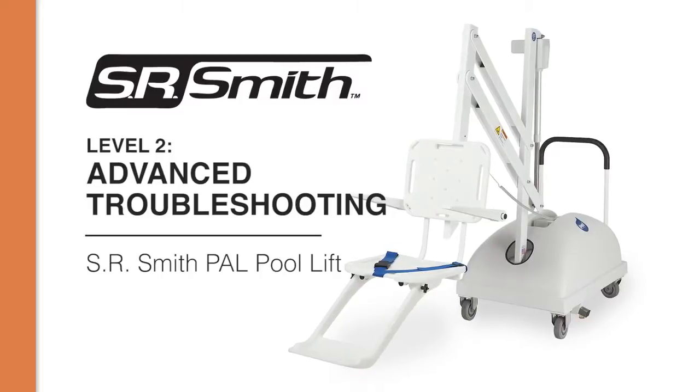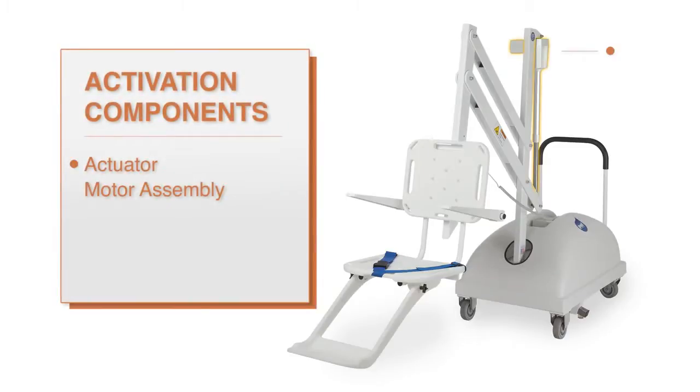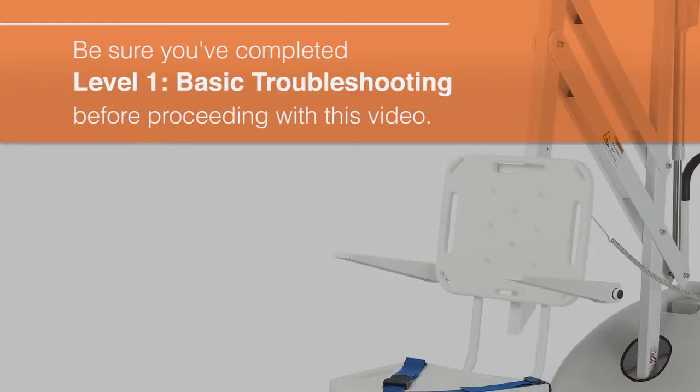In this video, we will demonstrate how to closely inspect and troubleshoot the key components of your lift. We will test the actuator, the motor assembly and gears, and the control box by using the control functions of the touchpad and the hand control. Before performing any of these inspections, please make sure to review the basic troubleshooting steps covered in the Level 1 video.